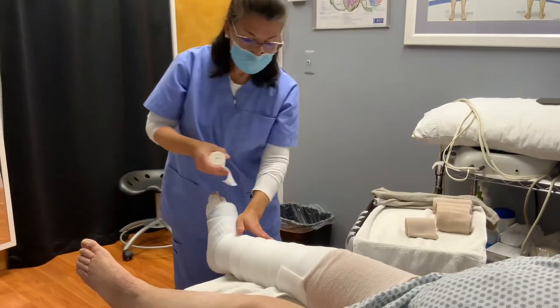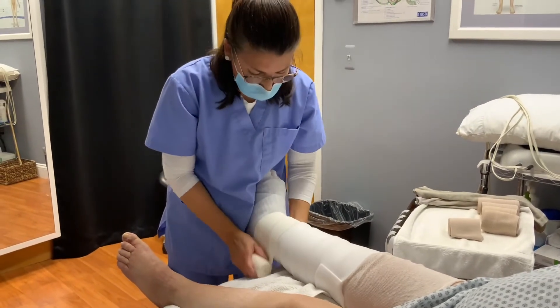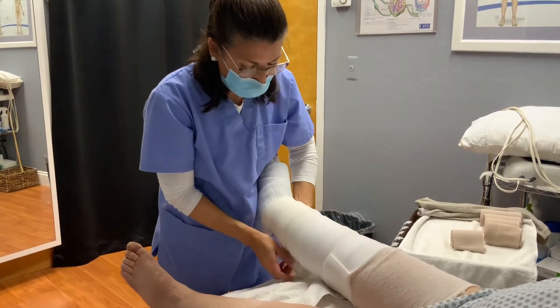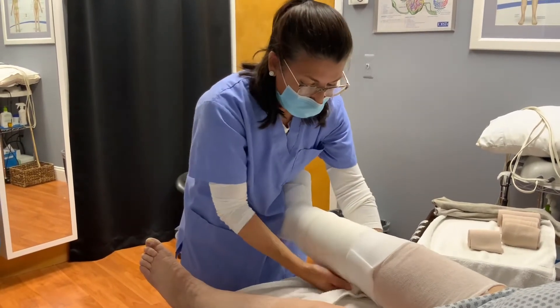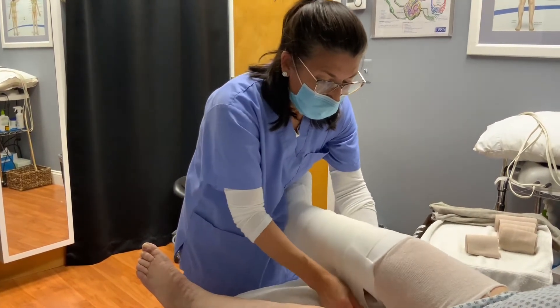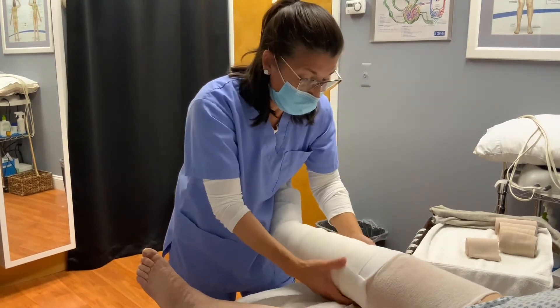You can help contain the white foam with isoband, which keeps it all in place. This is why it's called multi-layer. As the patient progresses and there is less need for all these bandages, you can diminish some of them — or sometimes you may need to use more.